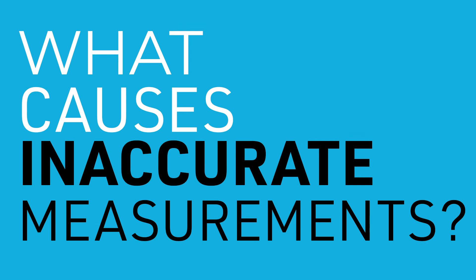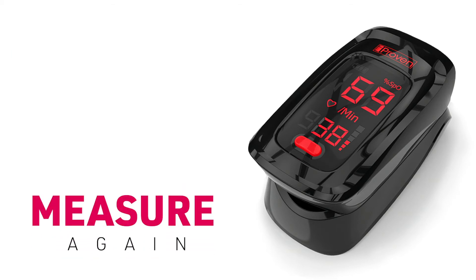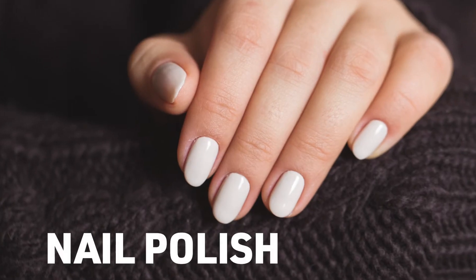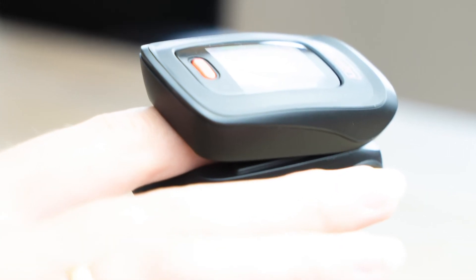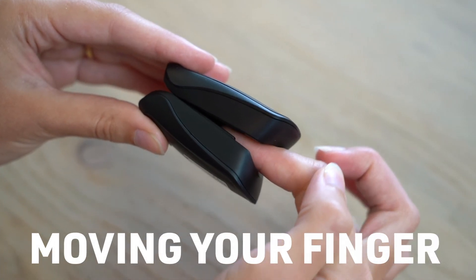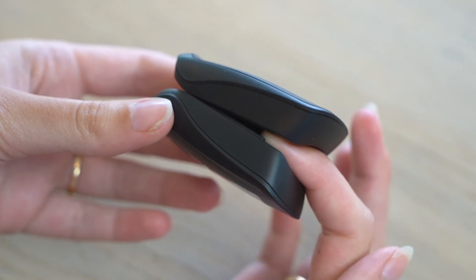What causes inaccurate measurements? When the numbers displayed on the oximeter seem unrealistic or even absurd, try to measure again. Make sure to pay extra attention to the following, since these may cause inaccurate measurements: nail polish, cold fingers, excessive ambient light, low battery, moving your finger around inside the device, or not properly positioning your finger inside the oximeter.